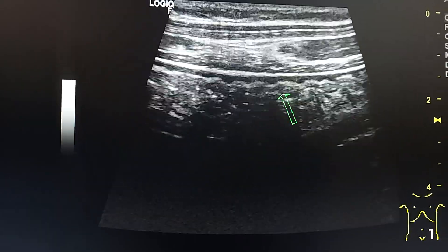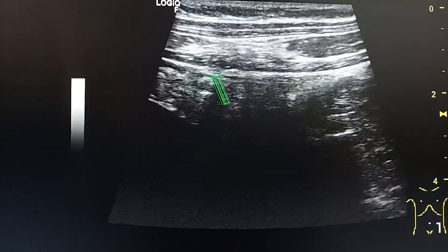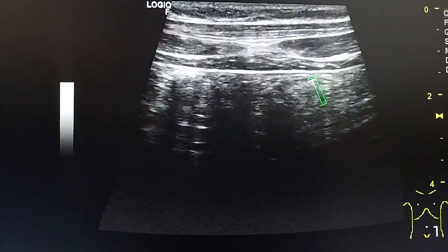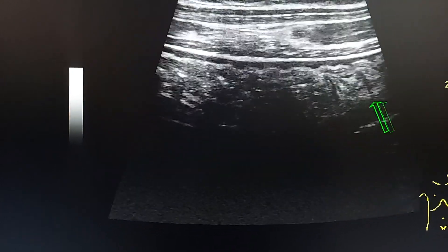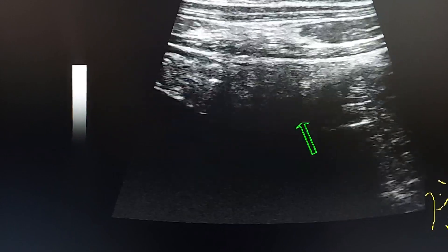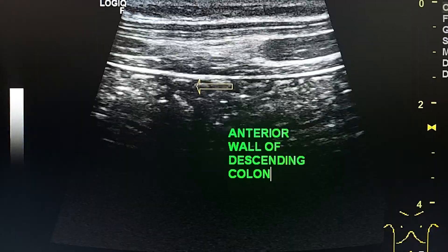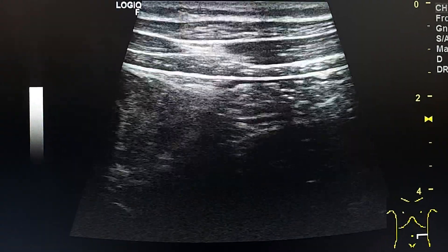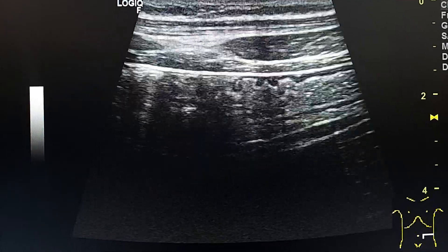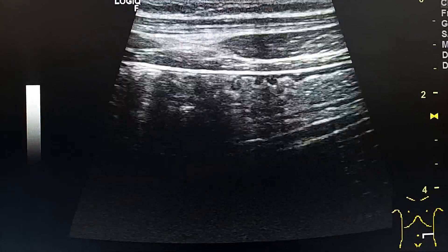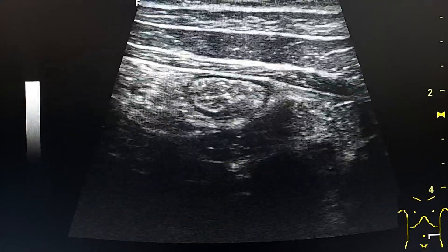Here we see the descending colon in longitudinal section. This is the anterior wall and this is the posterior wall. This is the psoas muscle. When we rotate the probe 90 degrees we can see both the transverse section and the longitudinal section.